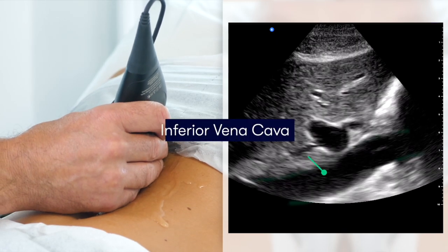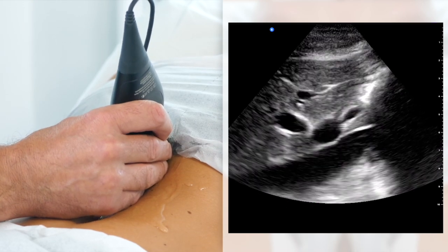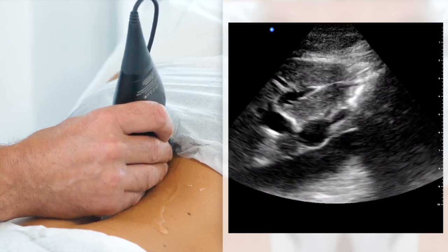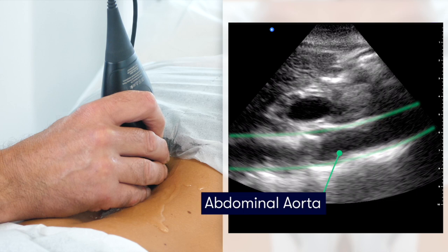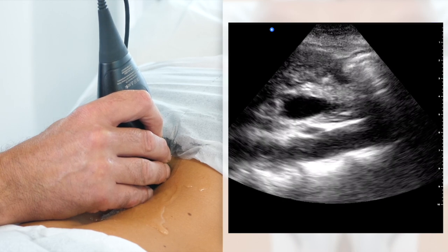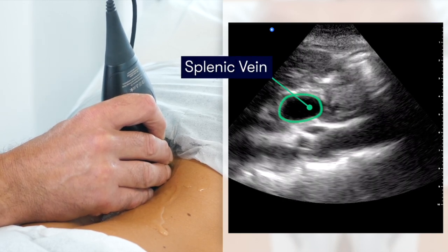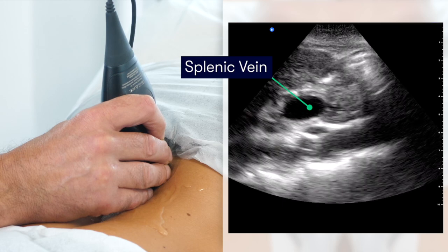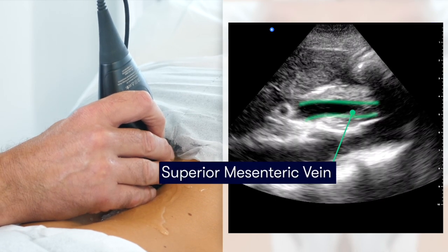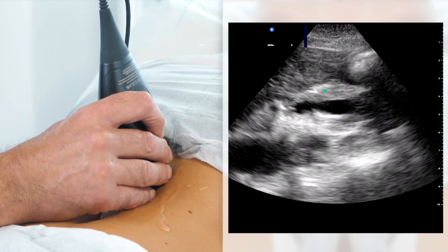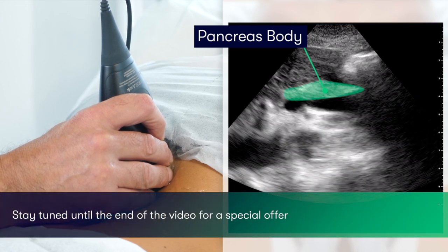The deeper structure visible there is the inferior vena cava, and we can see the hepatic veins draining into it. Moving over to the left, we can see the pulsating abdominal aorta. Superficial to the abdominal aorta, we're able to appreciate the splenic vein in cross-section. Moving slightly to the left, we can visualise the superior mesenteric vein as it drains into the splenic vein. Here we can also appreciate the sagittal view of the body of the pancreas on the surface of the splenic vein, located between the liver and the superior mesenteric vein.